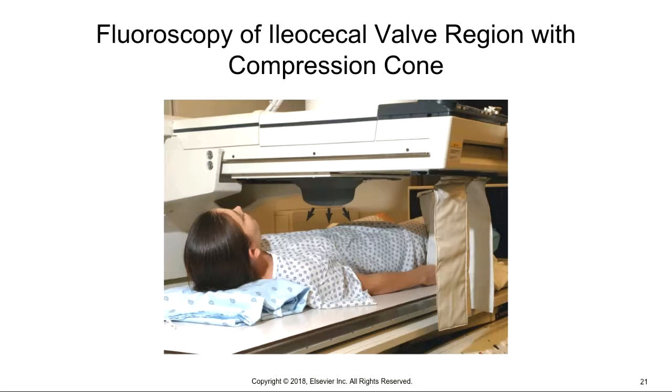When they go ahead at the end, when the barium has gone through the ileocecal valve, and I said that they have to take a spot image with the fluoro tower, the reason that's done is to prove that the barium has passed through that ileocecal valve. So on here, you can see the fluoro tower is right here. This is what comes across the patient. It's got lead drapes on here to protect the radiologist and the technologist.